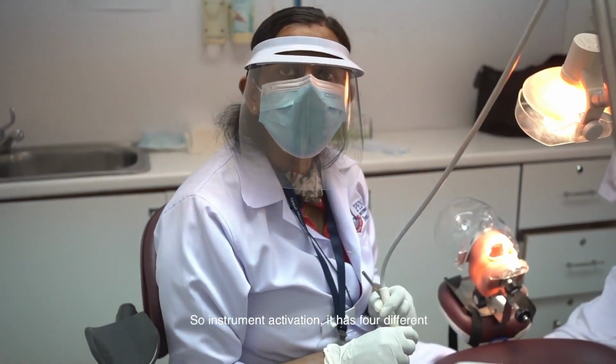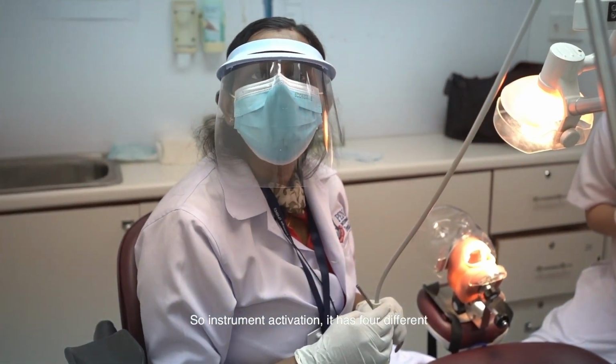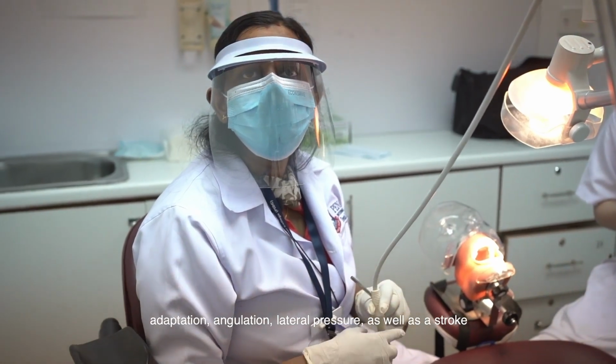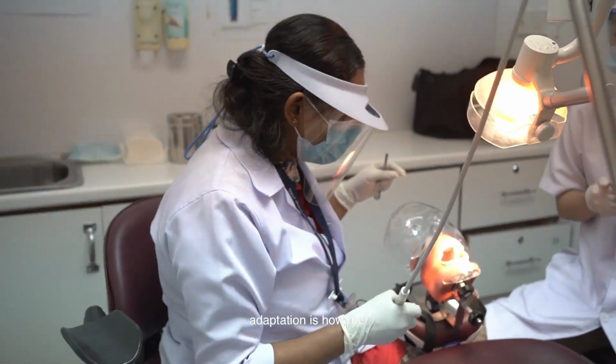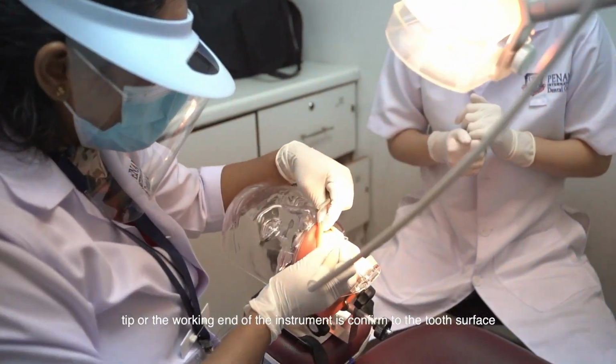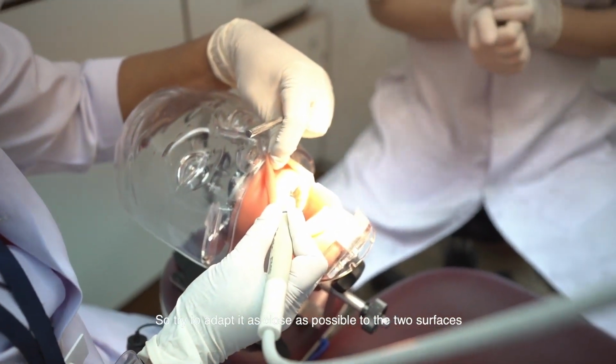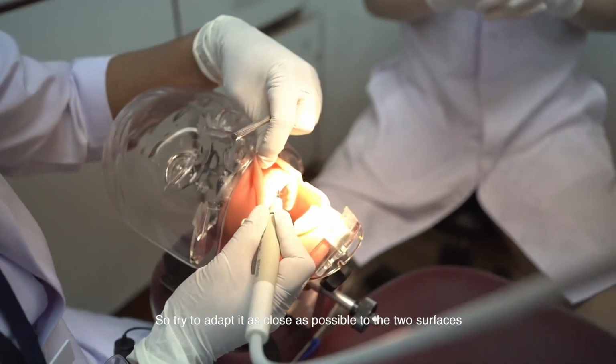Instrument activation has 4 different components: adaptation, angulation, lateral pressure, as well as the stroke. Now coming on to the adaptation. Adaptation is how the tip or the working end of the instrument is conformed to the tooth surface. So try to adapt it as close as possible to the tooth surfaces.